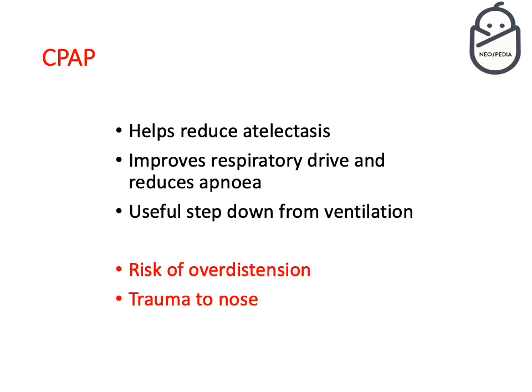What are the risks? I think we're all aware of the risks. You're blowing the lungs like a balloon, so there is a risk of overdistension, and there is also a risk of pneumothorax due to that. Also there is a risk from the CPAP mask of causing trauma to the nose or the nasal bridge, mainly.